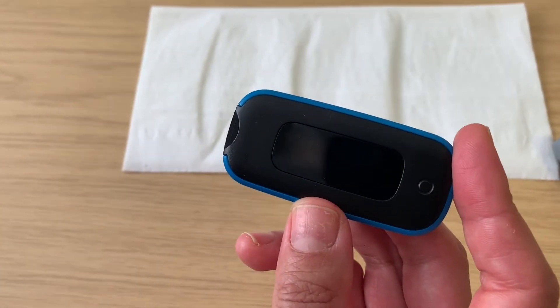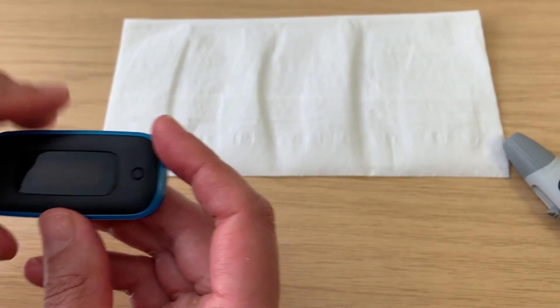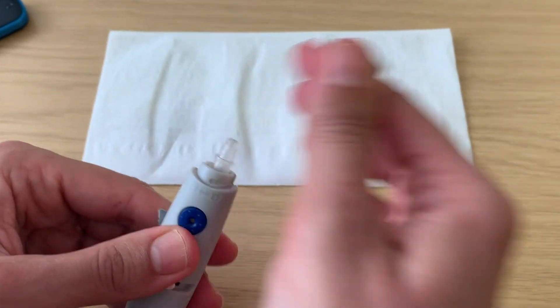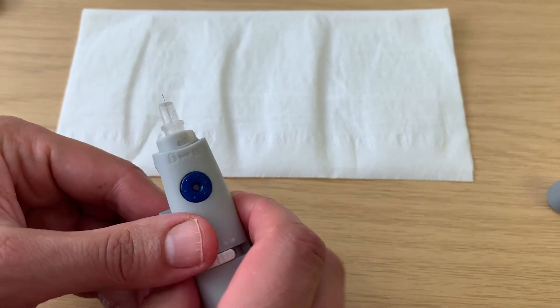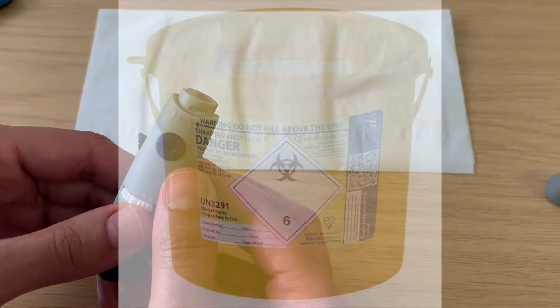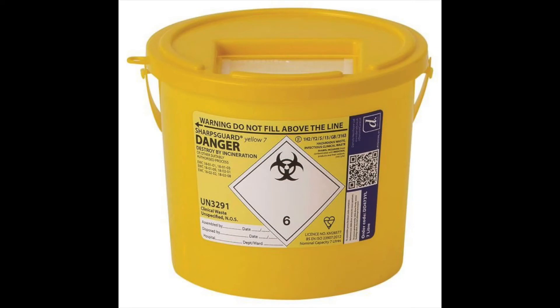Dispose of the strip into a bin. To change the needle, remove the cap, then over a tissue, push the side slider forwards to remove the needle. This should then be disposed of in a sharps bin. If you don't have one, place it in a hard plastic drink bottle.